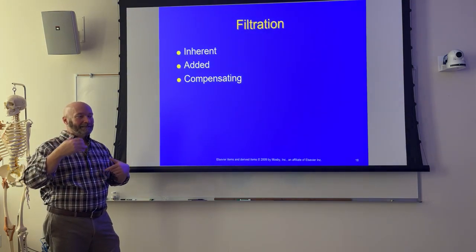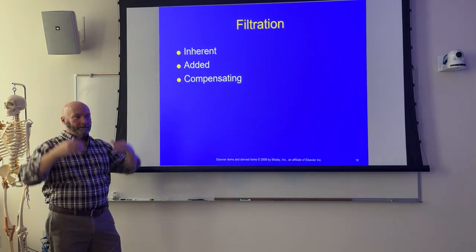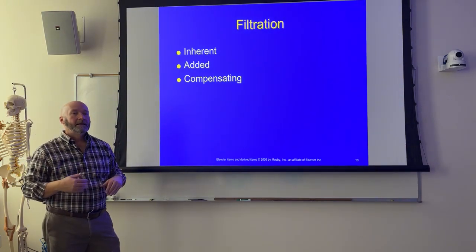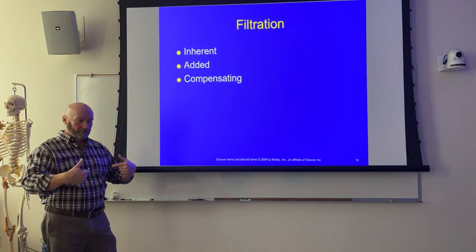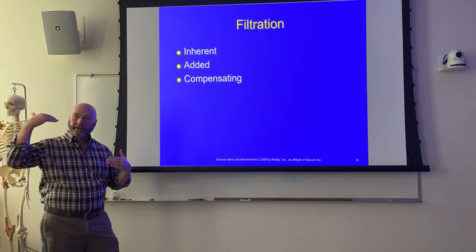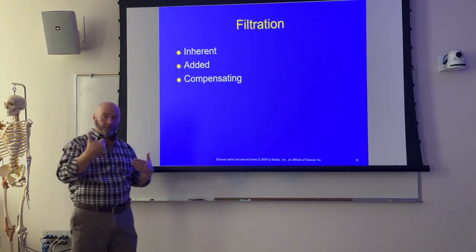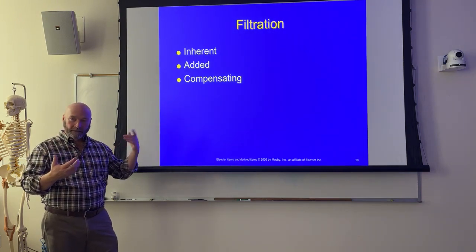So what that did is, and this is something that went into the collimator housing, is slid it into this slot on the collimator housing, so that the thick end was over the neck and the thin end was over the stomach, the lower portion of the T-spine. And that would change the output between the top and the bottom so that I have fewer X-ray photons penetrating through that filter. Numbers, right? We'll get into that here in a second.